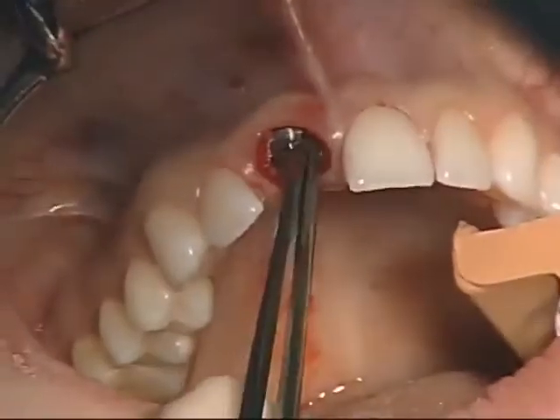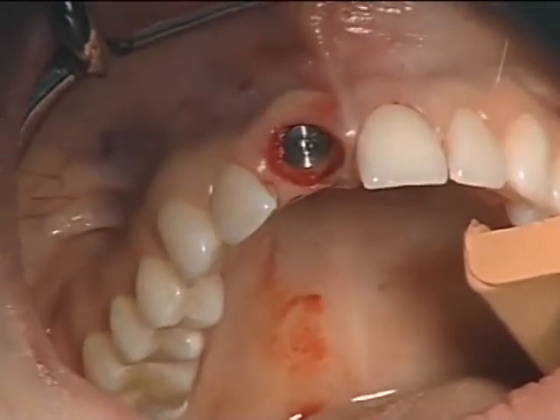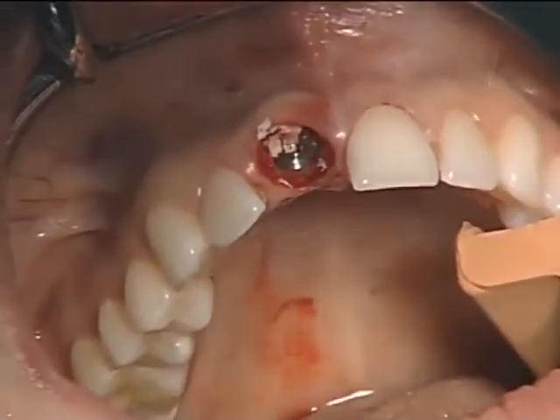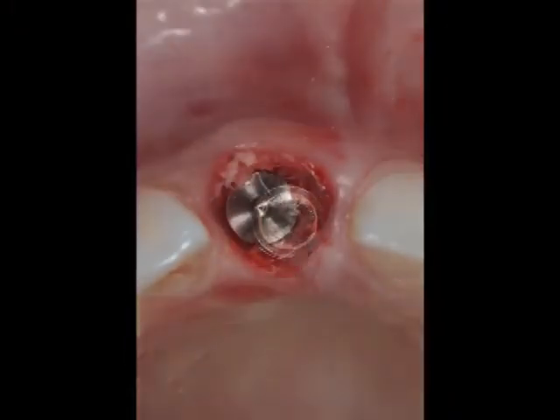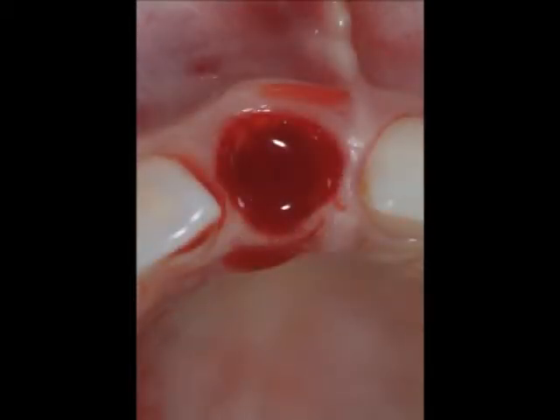And now I'm just going to a blunt instrument to do the further condensation of the crestal portion. And you can see just how much grafting material we can get into this pouch to reconstruct that buccal plate to the proper surface that it needs for long-term stability and support. And you can see from the occlusal aspect just how much grafting material is placed between the implant surface and the buccal tissue, hence really reconstructing the entire buccal portion in parameters around 360 degrees of the implant itself.